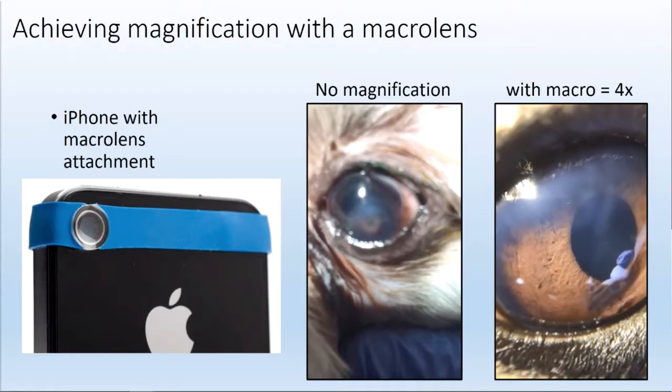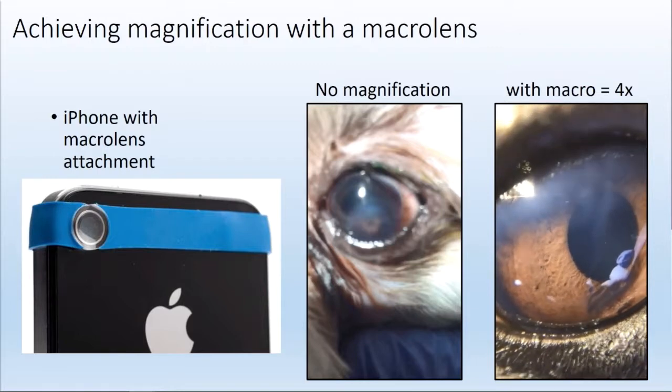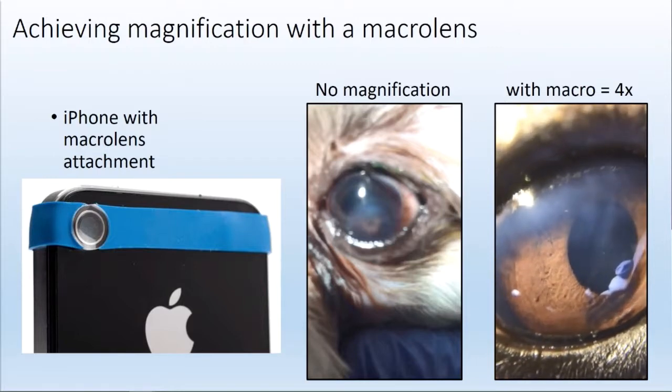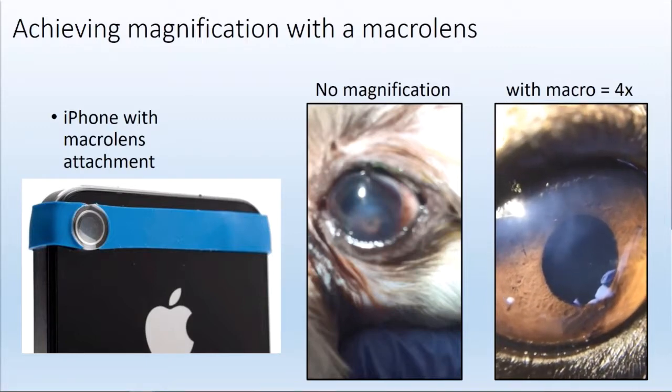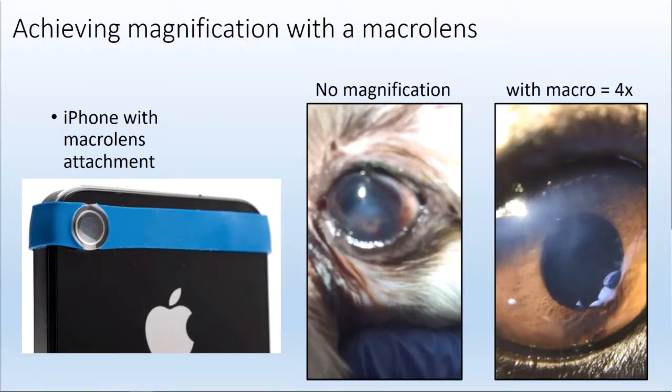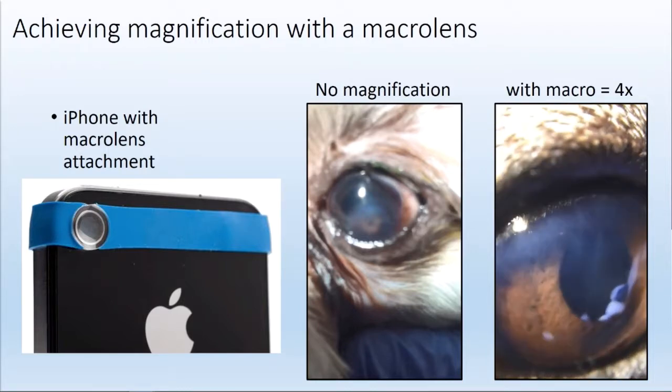So the iris is wobbling. This is called iridodonesis, and it can only be one thing. This is a lens that's fallen into the back of the eye that's no longer supporting the iris, and the iris gets floppy. So it's a lens instability.